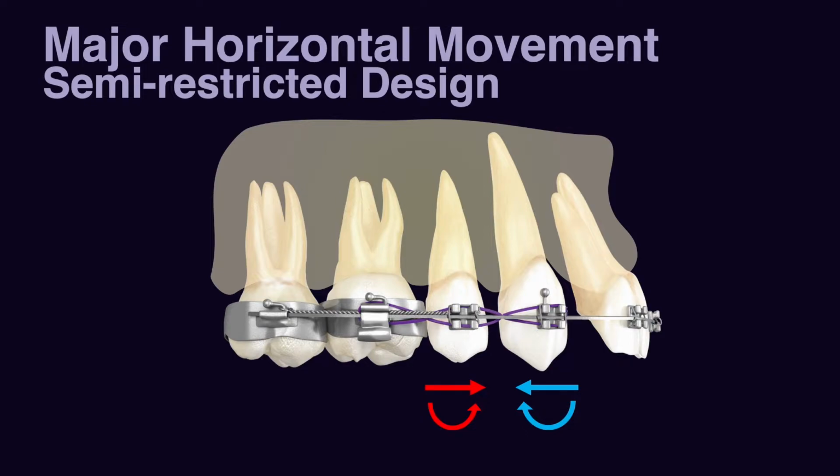But what happens if we put a wire between the anchor unit and target unit and we apply the same forces? Again, the primary forces, action and reaction, appear in the system. Again, action on the target unit will appear as blue arrows, the same moment, the same force, and reaction forces appear on the anchor unit as red arrows, same force and same moment.